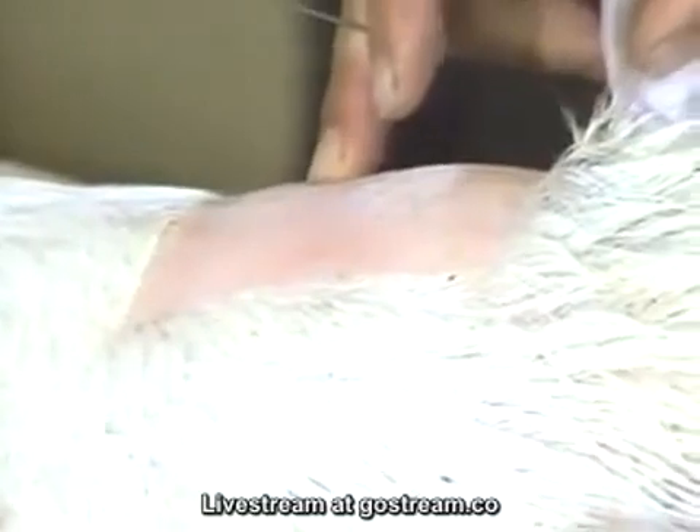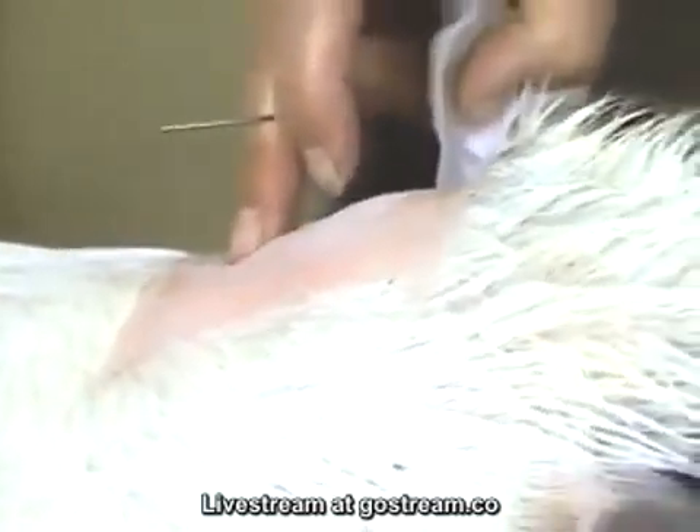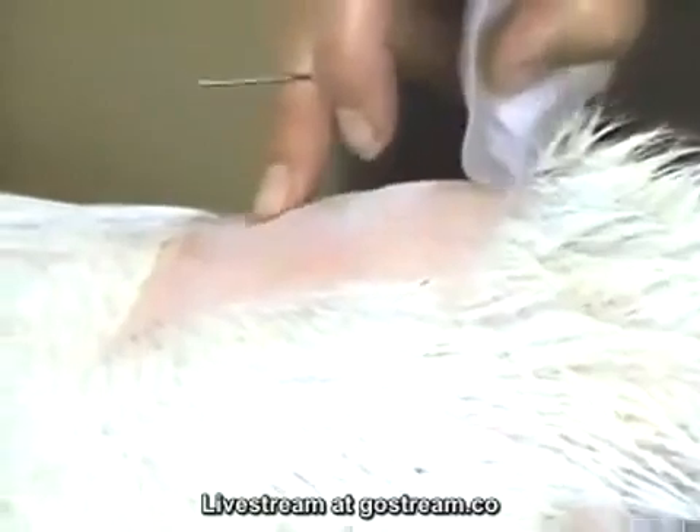The site that we would like to use can be appreciated here when I move the tail — between the sacrum and the first coccygeal vertebra, or as an alternate, between the first and second coccygeal vertebra. The first joint where you can see some movement will be the sacro-coccygeal junction. You can feel it as a little depression, an area that kind of compresses on your finger as you elevate the tail. That's the best site.